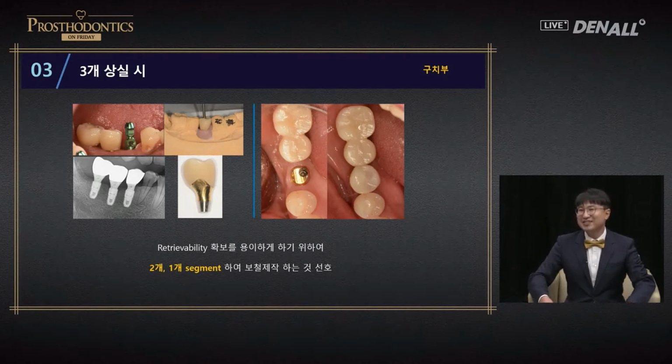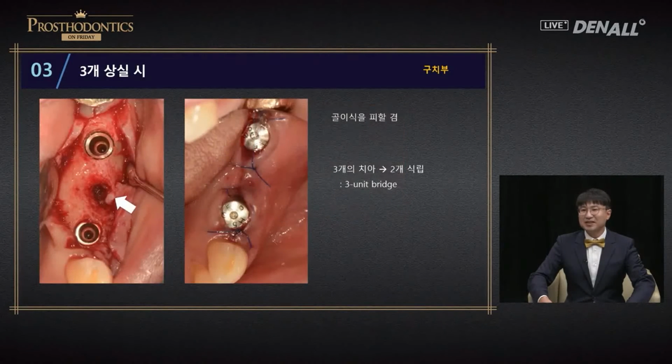The issue of floss not going in after cementing implants. Have you ever experienced it? It's an ongoing source of stress for me, and it can be problematic. Therefore, at times, I just splint all 3 clinically because it's much easier. To avoid bone graft, I placed 2 implants and did a 3-unit bridge.